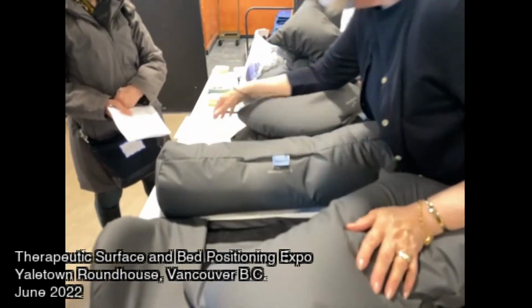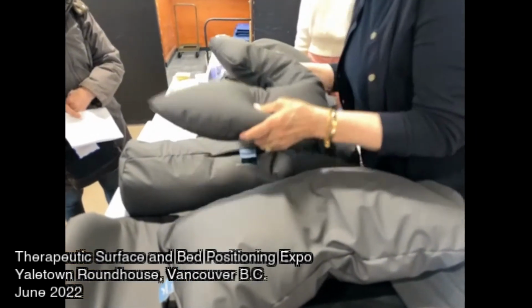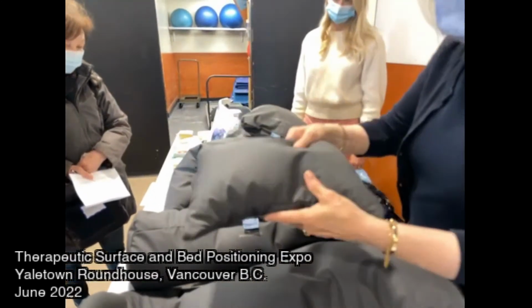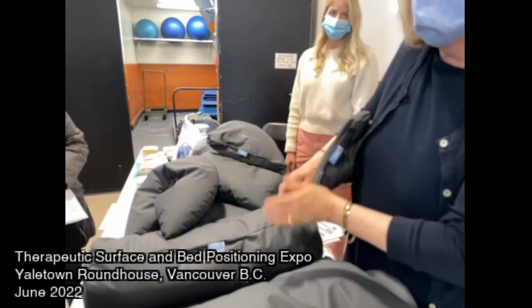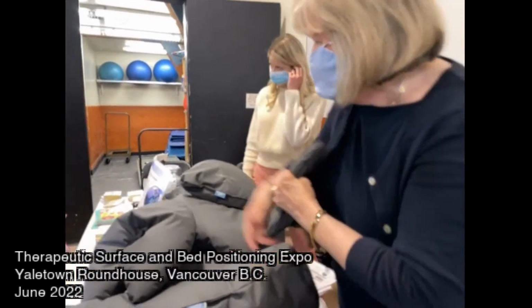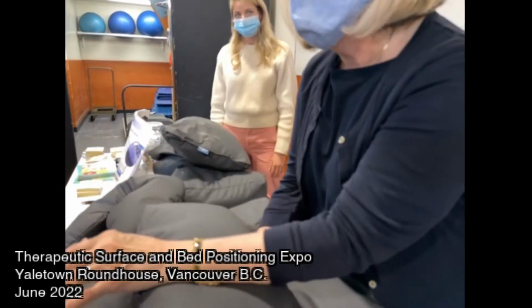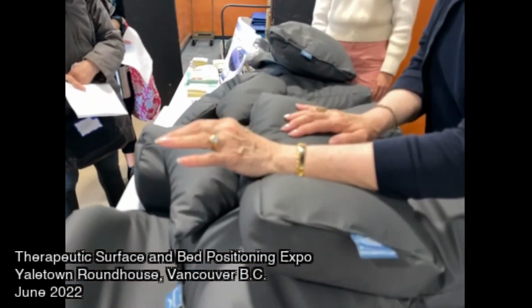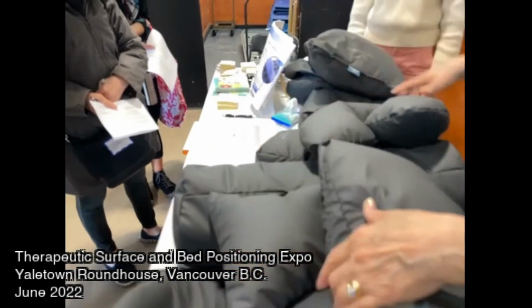Now for the positioning of the client, I have the pictures here of the case study, and you'll see that again, using the abductor cushion for the knees, this would work and stay in place. For her hand, the best thing would be to put it underneath the arm, so it wouldn't be right on, and it would lift it from the pressure on the hand. For the heel, you can place the heel so that it's raised up, and then the cushion just molds to the leg of the client. So then that would take care of the pressure injuries there.